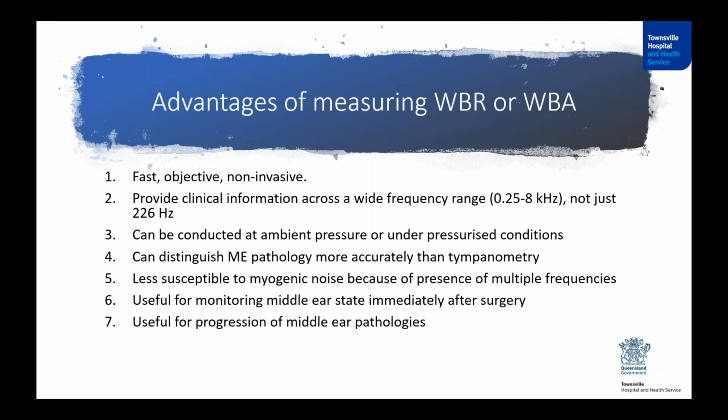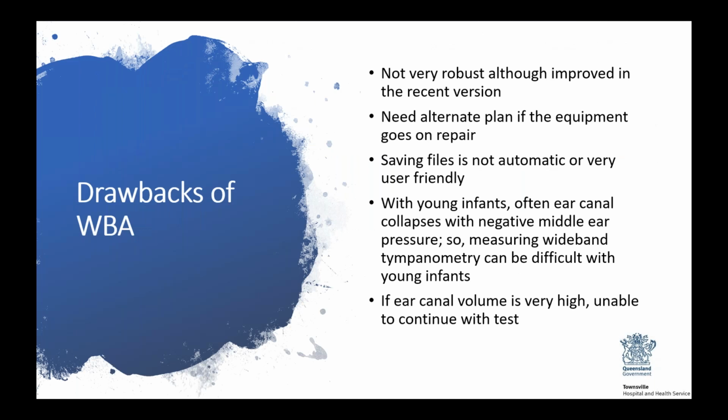of middle ear pathologies. Having said that, wideband absorbance has some drawbacks as well. In the recent versions, there have been improvements compared to the previous versions, but I think there's still a bit more work that could be done. We found that it's not like a tympanometer, it's not standalone equipment. So at this stage, I think it can be an additional test, but you can't rely only on wideband absorbance as the only equipment in your clinic.